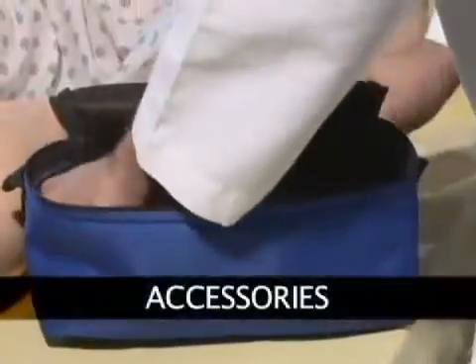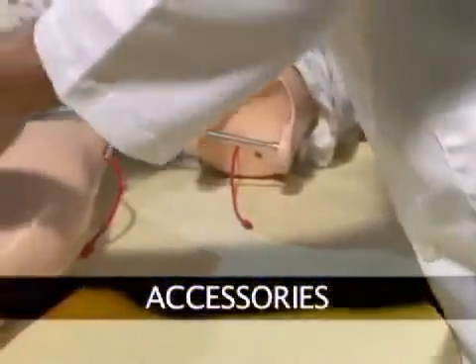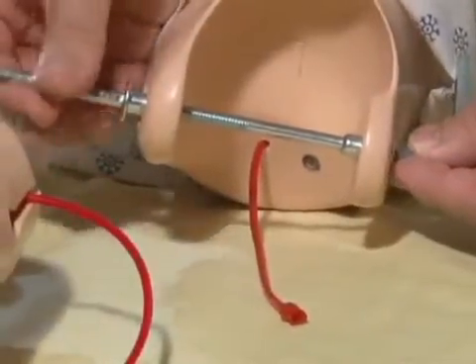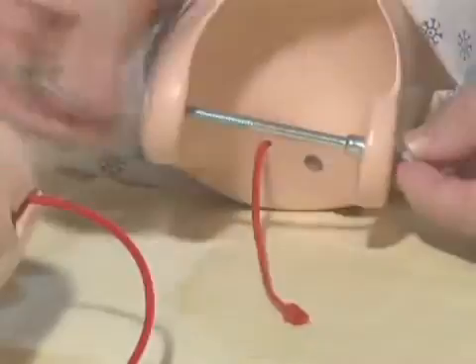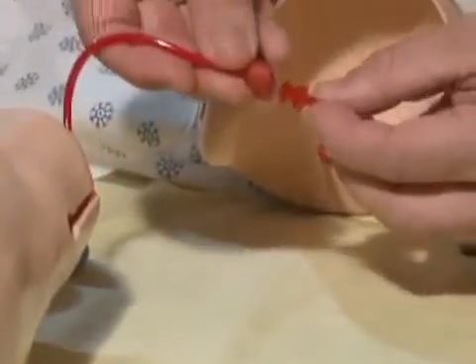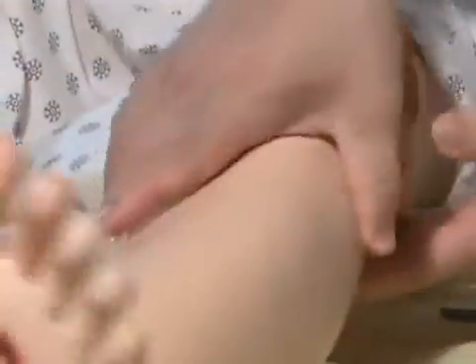Inside Susie's carrying case you will find a blue bag containing several accessories. Remove the allen wrenches from the bag and detach bolts from the knees. Connect the matching red tubes protruding from the calf and upper leg. Once the tubes are connected, attach the lower legs as shown.